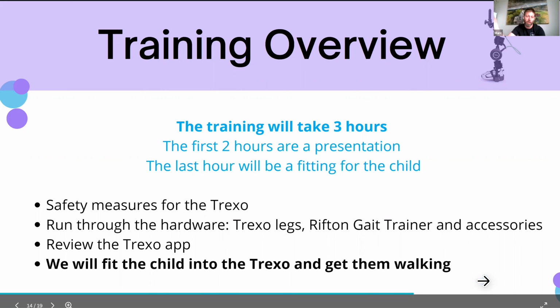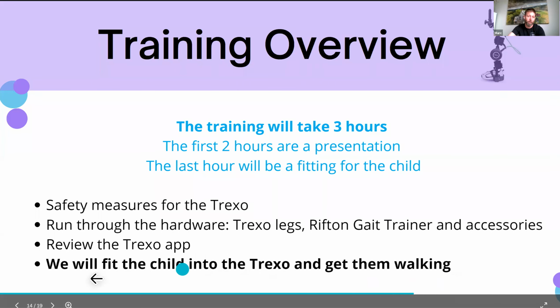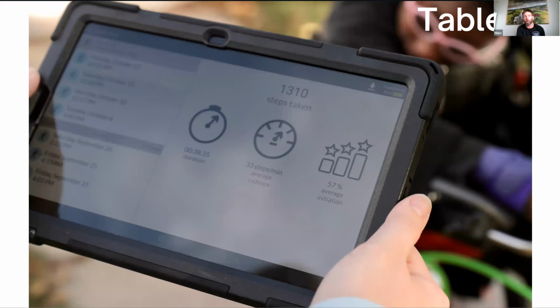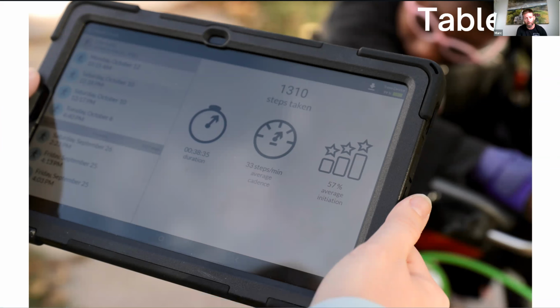That's when we start to get into the regular check-in routine that you'll have with me going forward after the training, where we do size adjustments and do all these other things to your device to make it more difficult or complicated, or easier, depending on how your child needs to be supported, because we can tweak it one way or the other.